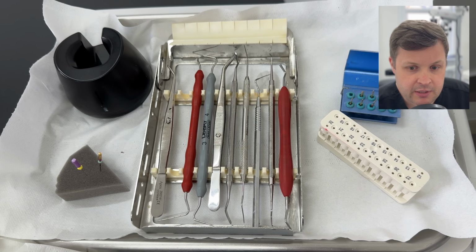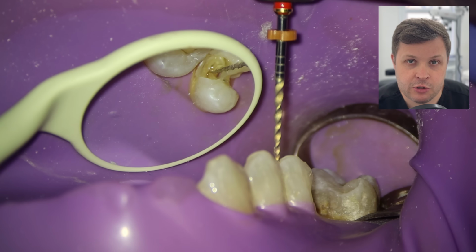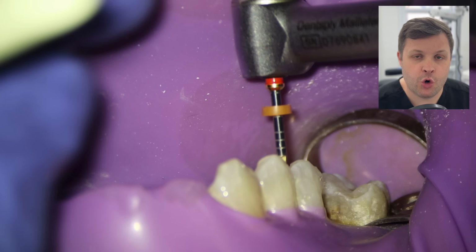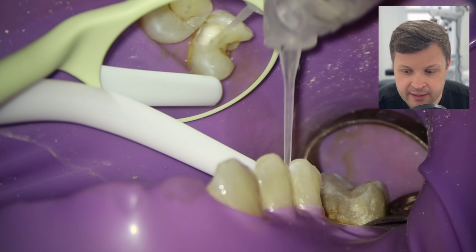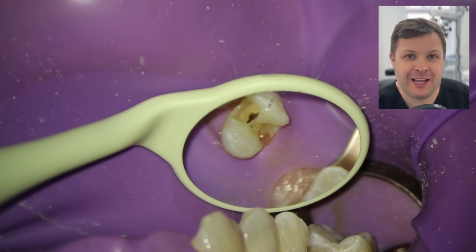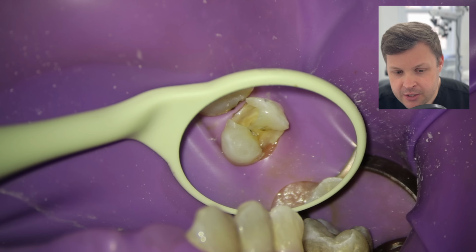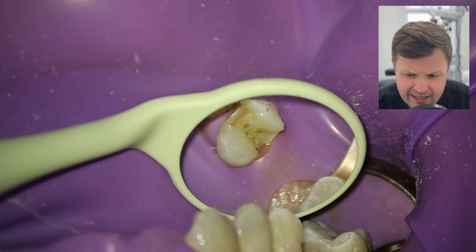And then, same protocol as before. It's a little bit higher torque, a little bit higher rotary action, but in this case, it should always be used passively. So there's no pushing these files to length. I think when I was newly qualified, I used to love shaping and pushing quite hard, but I'd made too many mistakes.